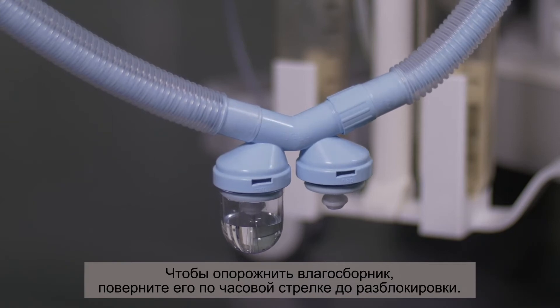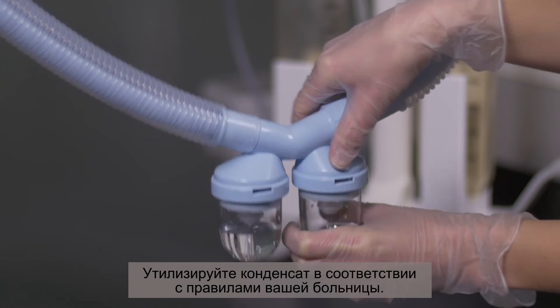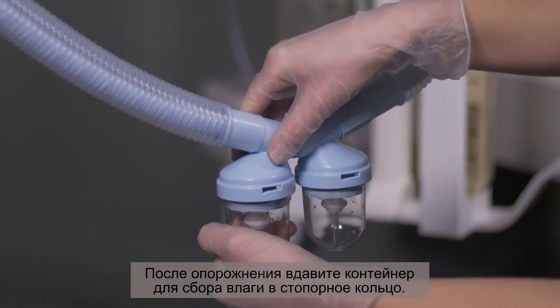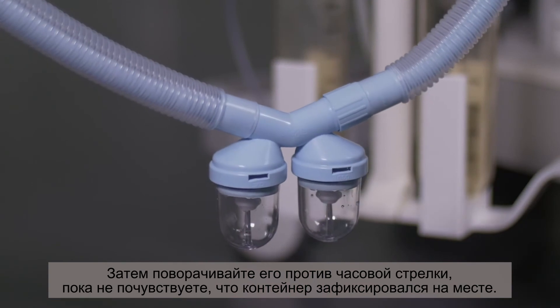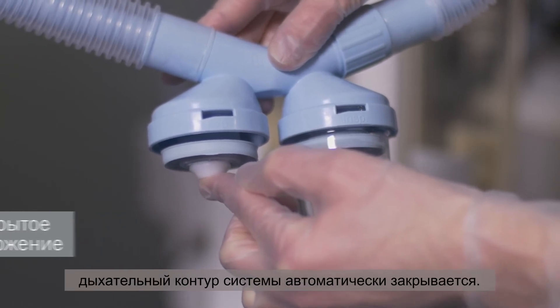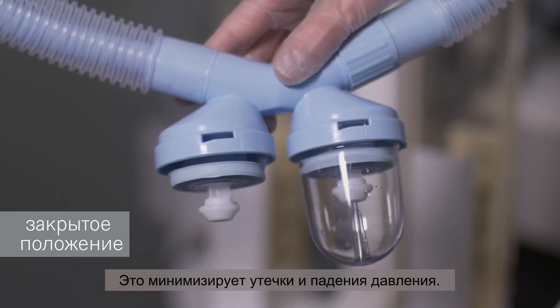To empty the water trap, rotate it clockwise until it unlocks. Dispose of the condensation in accordance with the regulations of your hospital. After it has been emptied, tightly press the collection container into the lock ring and turn it in an anti-clockwise direction until you feel the container lock in place. When the collection container is removed, the system's breathing circuit automatically closes. This minimizes leaks or pressure drops.